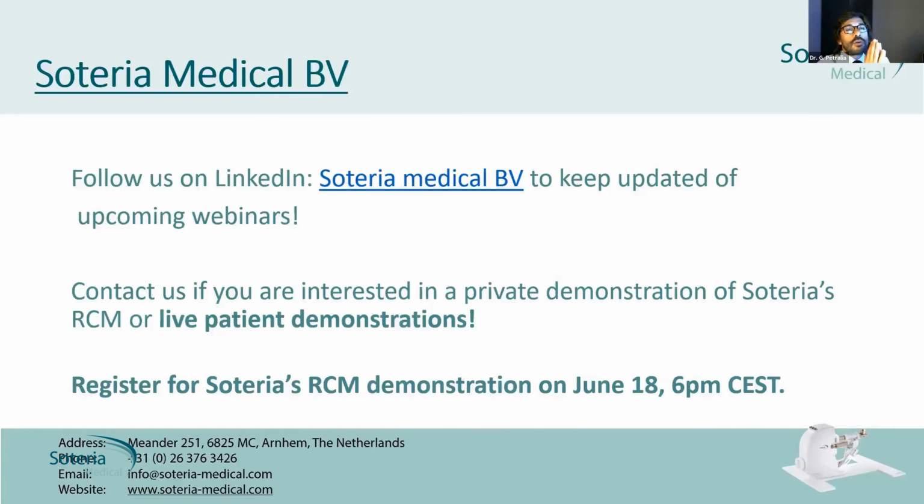Well, of course, as with any transrectal biopsy, you need antibiotic preparation. But if you do a proper antibiotic preparation, we have less than 1% in our experience. So it's not a big problem. Also, there's a lot of discussion on this. There are people who call it transfecal instead of transrectal biopsies. I think it is not the case. In my personal experience, I have just a few cases over hundreds, so it's not a big issue.